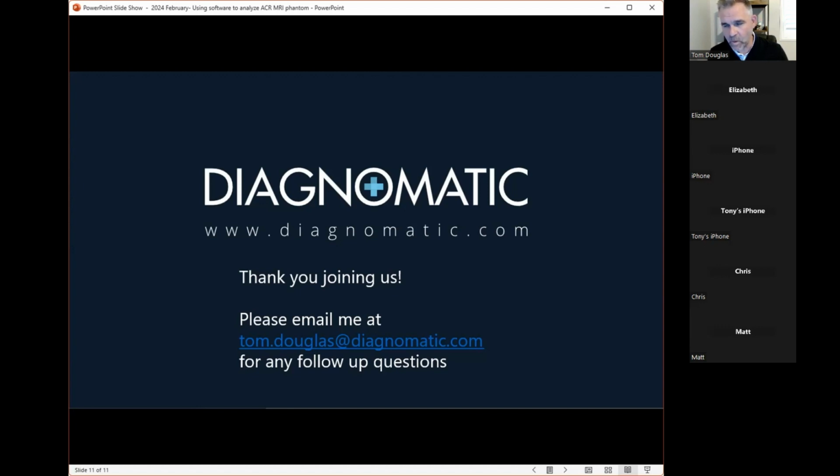We can help out with that. Just going to move on to questions. One that came up the past couple times, just to get in front of it, is we'd ask, will this work with the JM Phantom? Theoretically, yes, because the dimensions are all the same. It's built for ACR. We haven't physically run it yet, so we can't say definitively. If you have customers or end users, or even a Phantom you have access to scan some images with the JM, we'd love to run it through as well and confirm what we believe will happen. So we do want to throw that out there as an option.